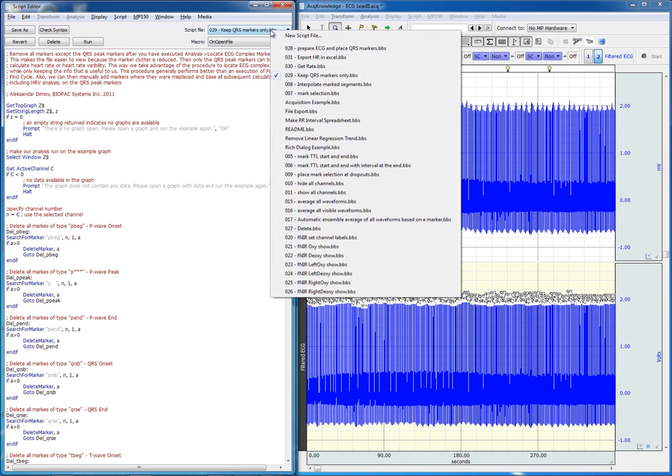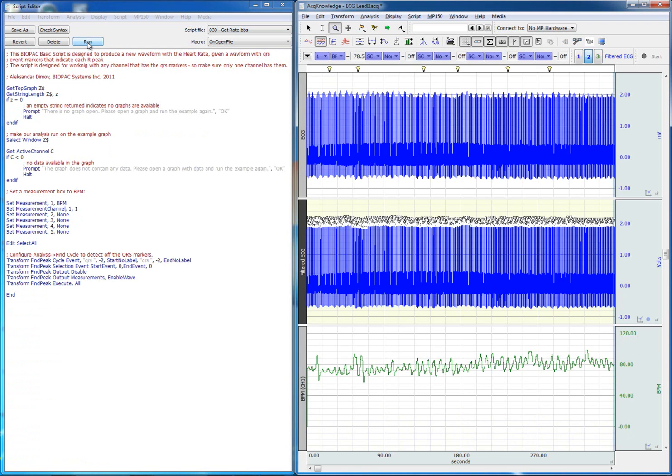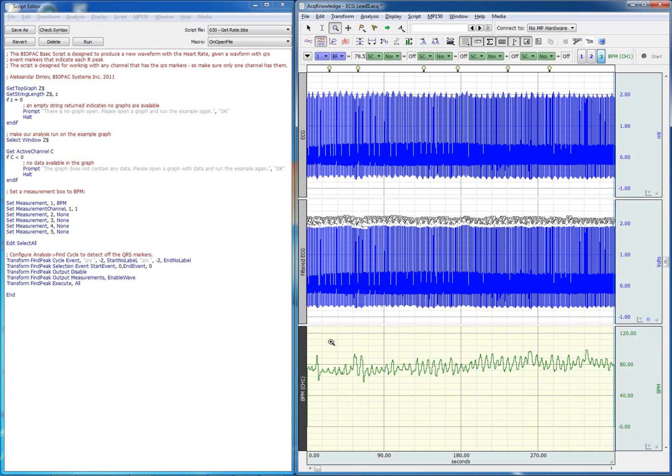The next step in our analysis would be to calculate the heart rate based on each of those QRS markers. And there we have a new waveform that gives us only the heart rate.